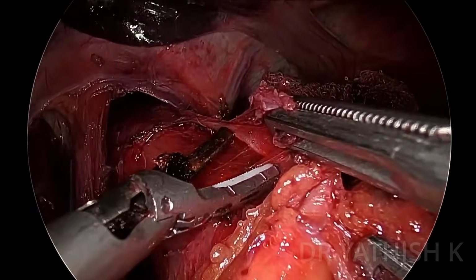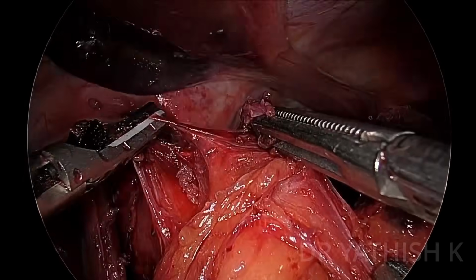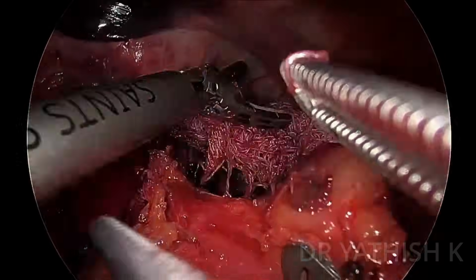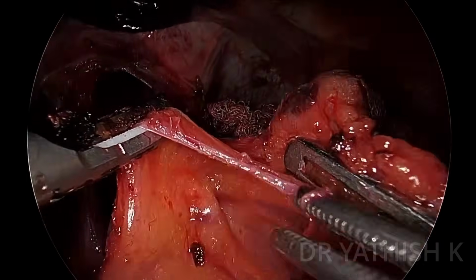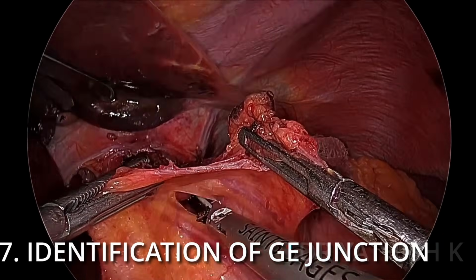Now that I'm mobilizing this anterior vagus, there will be minor bleeds. Whenever it bleeds at this point of time, never use an energy device because you'll have your esophageal serosa close by. Just give compression, that's enough.